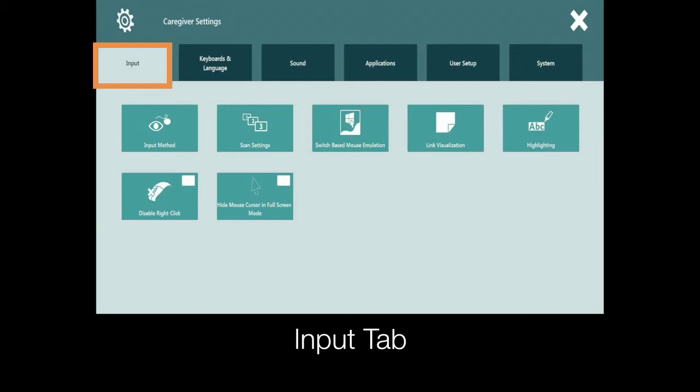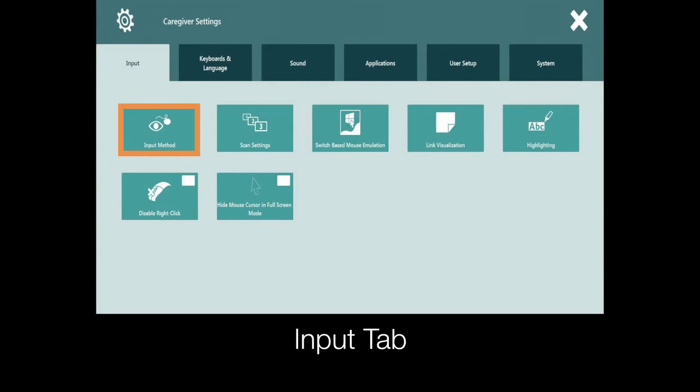We'll start with the input tab. The input tab focuses primarily on how the individual will physically access their device. Here you will set whether they will be using gaze interaction, scanning, or touch.